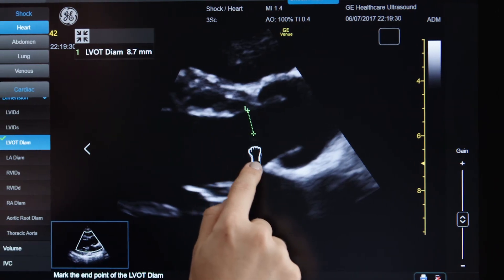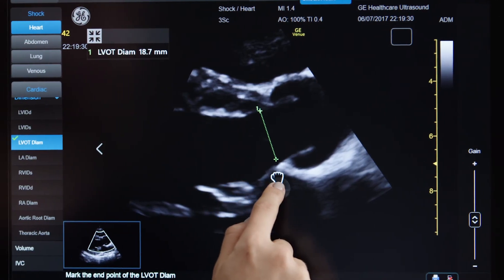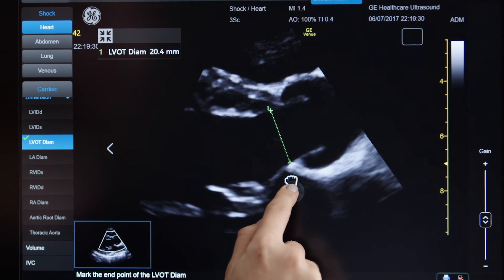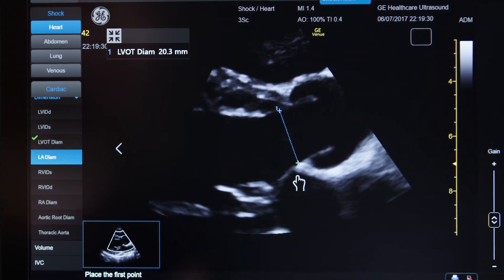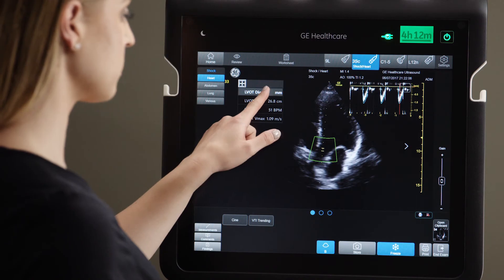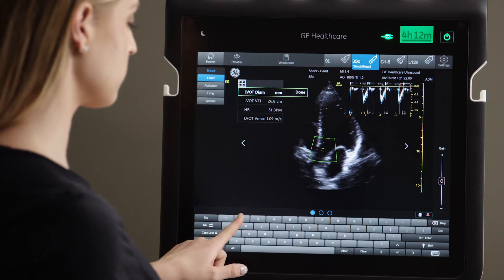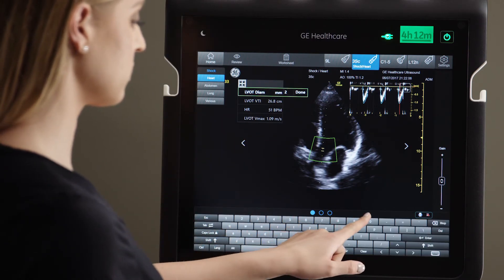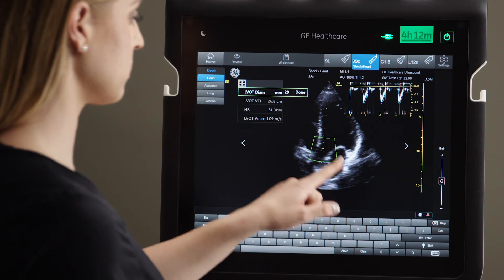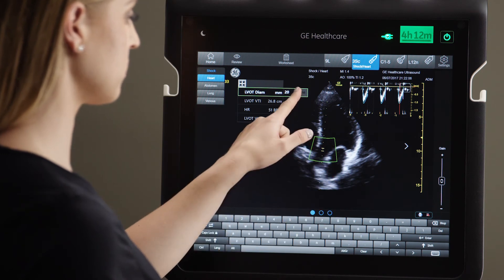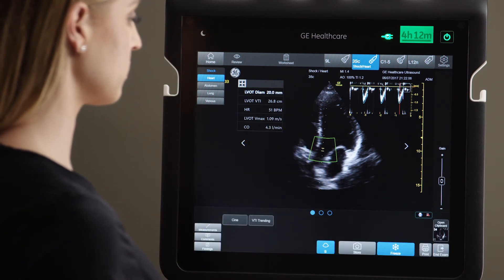And if you want to see cardiac output, measure the LVOT diameter or simply type it in if already known. Venue will calculate the cardiac output for you.